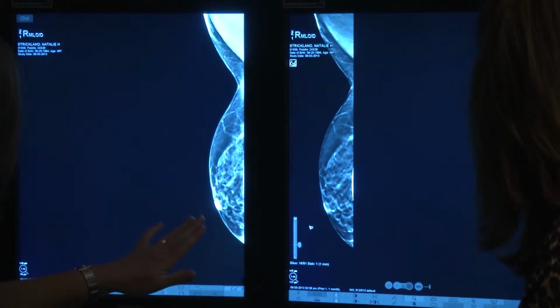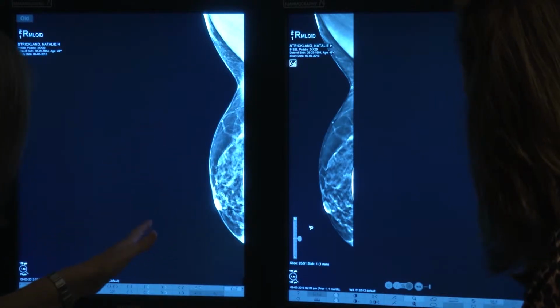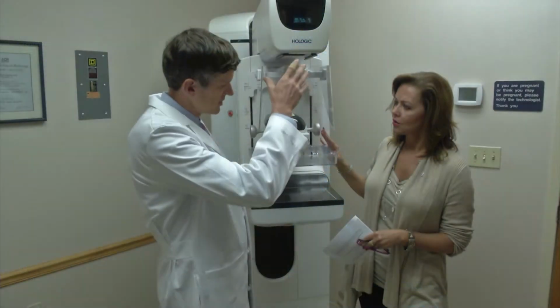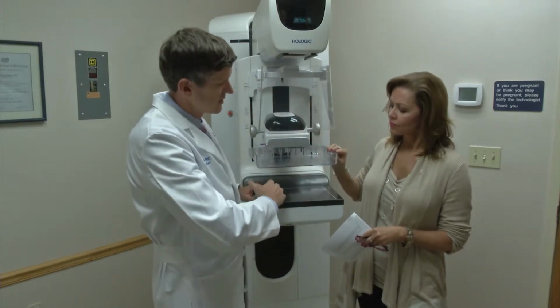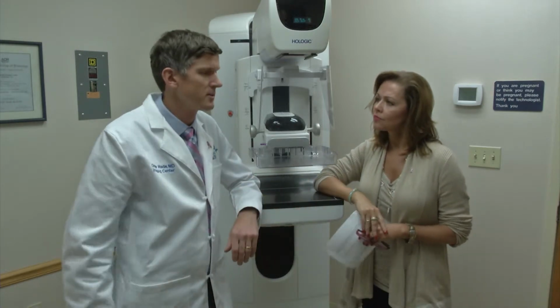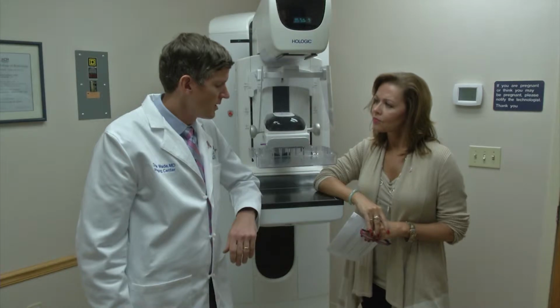The advantage we have for 3D mammography is that when this machine goes, instead of just taking a still image and shooting the x-rays through the breast once, it does a sweep and takes a series of 15 images or more, depending on the patient. In any case, it delivers back, after making some calculations, a stack of images that we can look through, taking each individual level one at a time. Whereas before we would have normal tissue overlapping that we couldn't see through, especially in a denser breast, now we can see through those and see things that we couldn't see before.